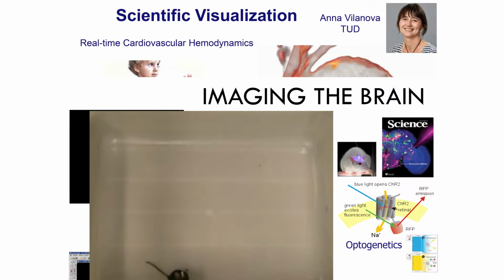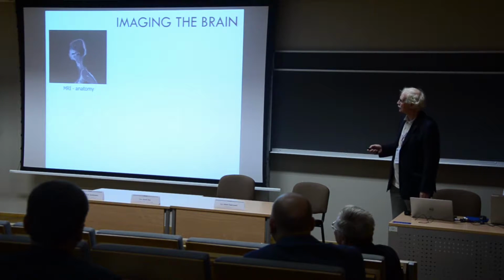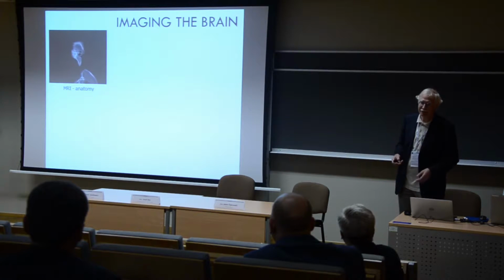We know all about MRI anatomy. This is my own brain. You see my spinal cord, the whole thing. This is wonderful. It has a superb resolution, but it's actually only anatomy.